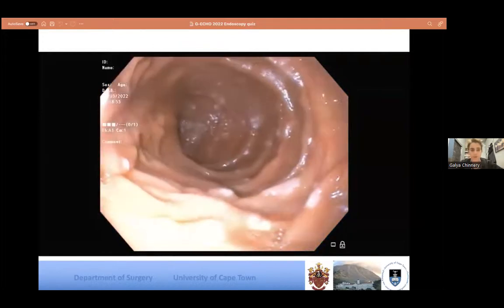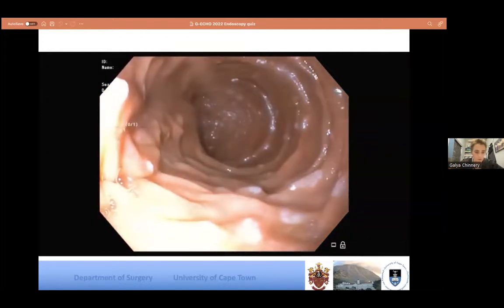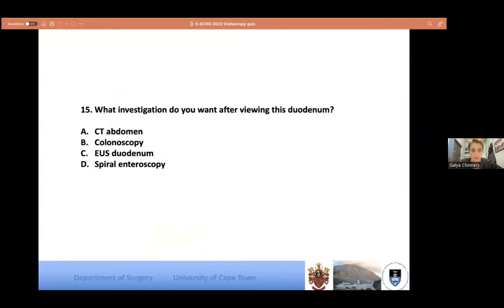And there you go, D2. Okay, so what investigation would you like? A CT, a colo, an EUS duodenum, or a spiral enteroscopy?